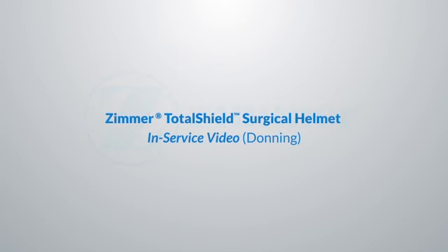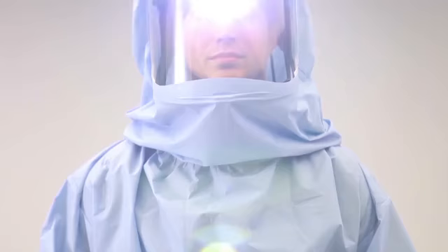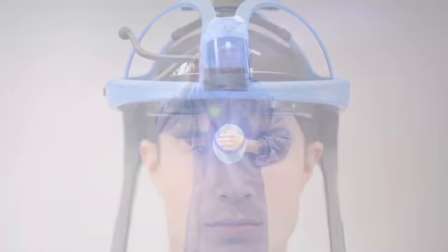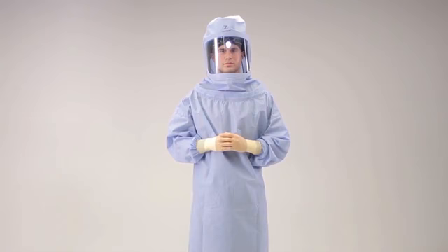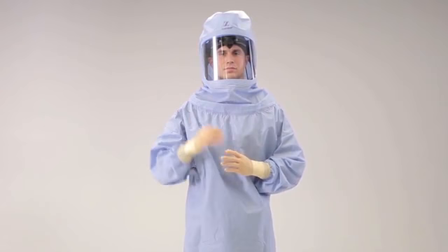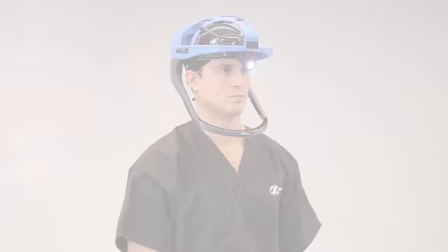Hello and welcome to the video tutorial on how to don a Zimmer Total Shield Surgical Helmet. The Total Shield Surgical Helmet and Total Shield Advanced Surgical Helmet with LED lighting are for use with the Total Shield Zippered Surgical Toga and Total Shield Surgical Hood. The Total Shield Surgical Helmet system is intended to be worn by surgical personnel to provide a barrier between the operating environment and the surgical personnel in order to protect against contamination and exposure of infectious body fluids and harmful microorganisms.